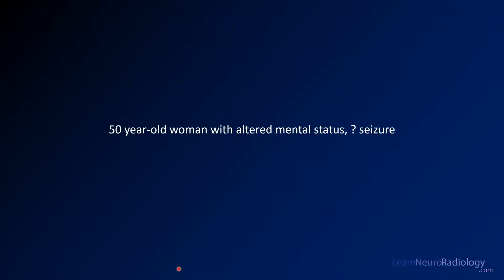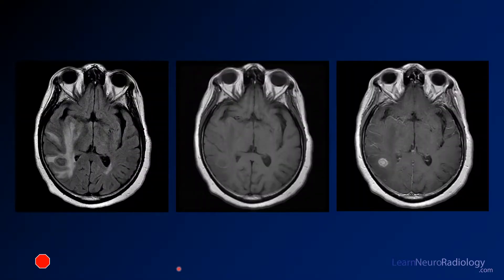Here we have a 50-year-old woman with altered mental status and questionable seizure. On MRI, the FLAIR shows an iso- to hypointense mass in the right temporal lobe with some surrounding edema. On pre-contrast T1, there may be a little thin rim suggesting hemorrhage, but not much. On post-contrast imaging, you see very avid enhancement.